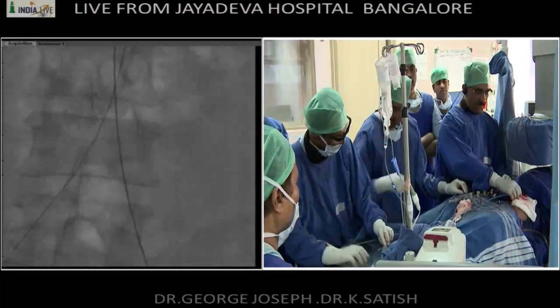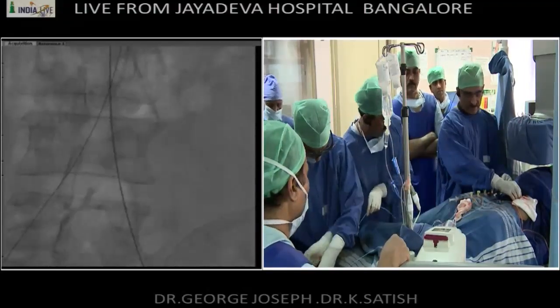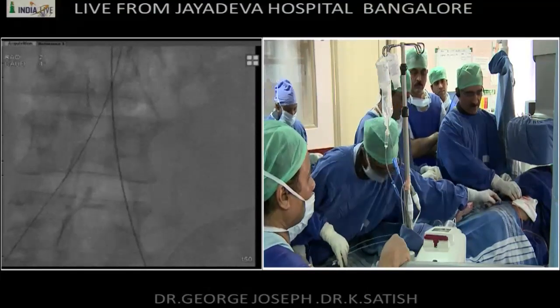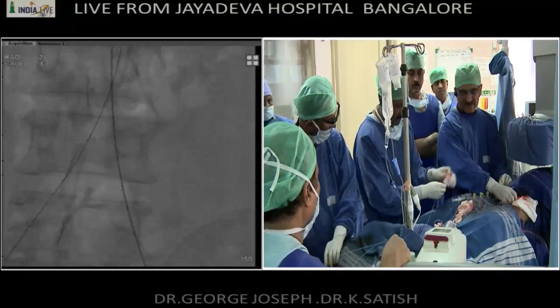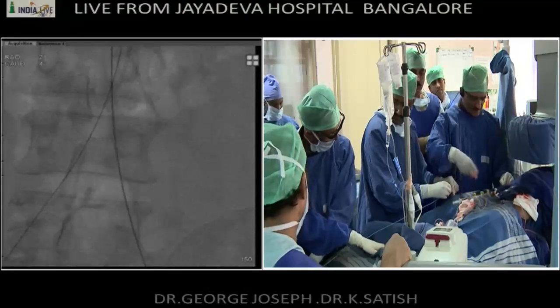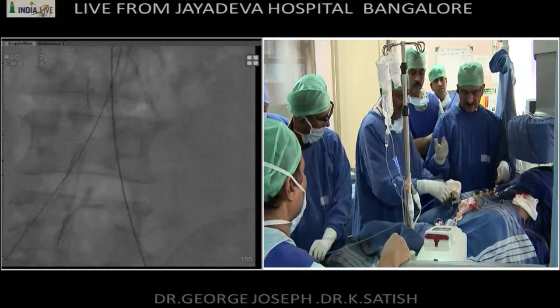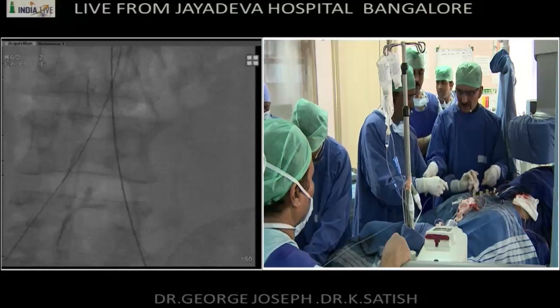You can, it's not impossible, but before you know it, it will flip out if you're not carefully holding it. And I've lost too many wires to take that risk. It just takes an extra 2 minutes to put these wires in. These stiff wires are very reusable, sturdy wires. You can use them 5 times, 10 times.